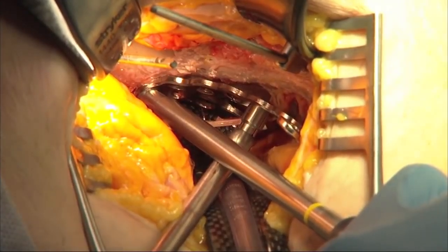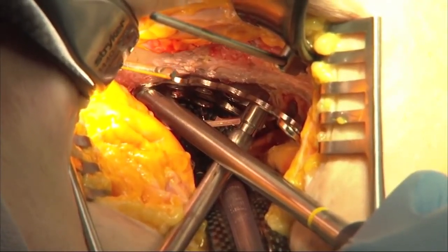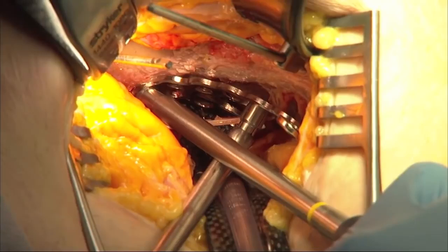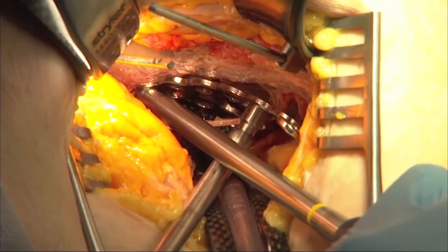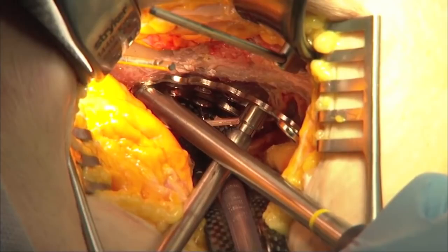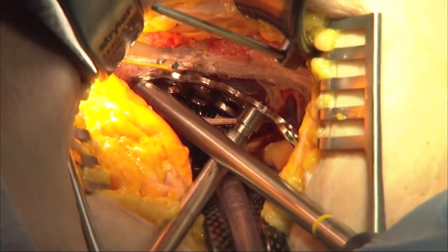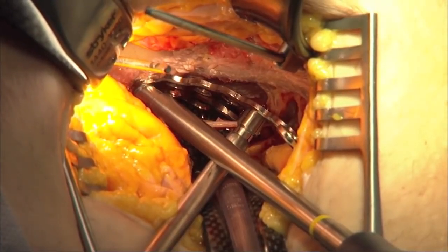And there's something important that you're going to want to tell your surgeons at this point that is different than the spike screw inserter. Using the plate screw insertion handle, you have to be careful that as the screw is being deployed and getting down near the plate, the screw head, if it goes too far, can actually trap the screw insertion handle into the plate, and you won't be able to pull the handle out of the plate. So there's a yellow mark on this power screwdriver that tells you when to stop so that the screw head does not capture the screw insertion handle and the plate.